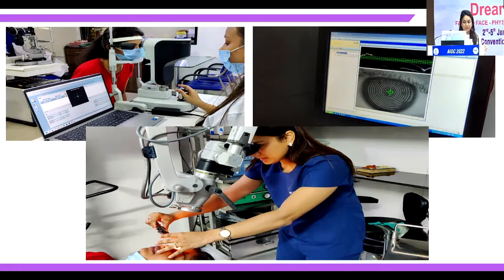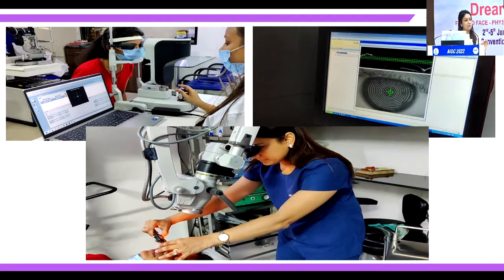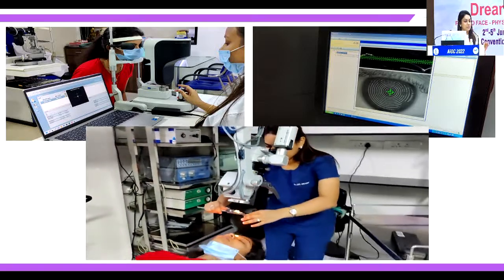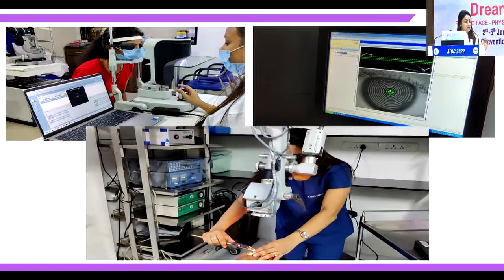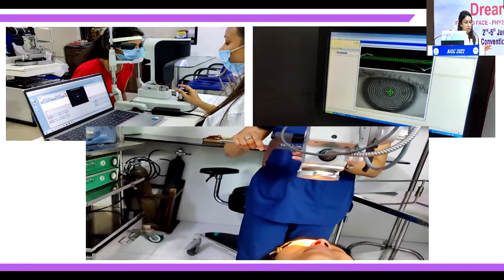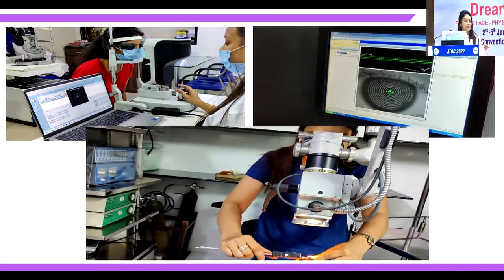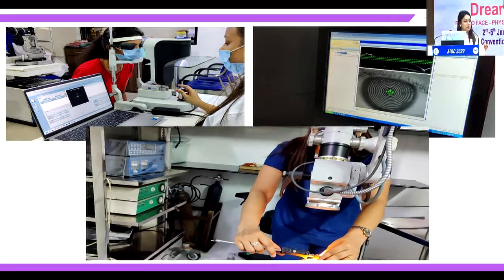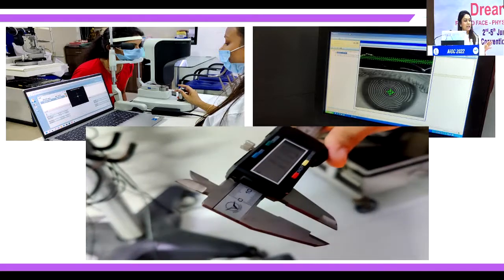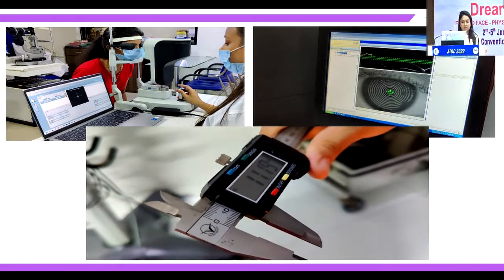for my white to white calculation, so that my IOL, my phakic lens power and the sizing doesn't go haywire. The most important step is to do your white to white calculation by using a digital caliper, because of course your optical biometers and your topographies will give you a white to white, but it's always a good habit to do your digital white to white calculation, and then match it with your other parameters.